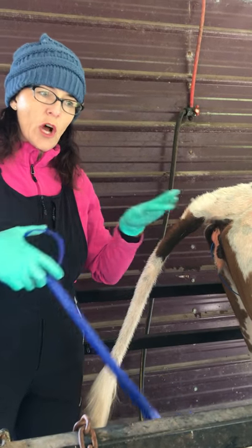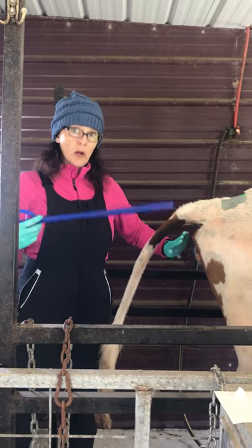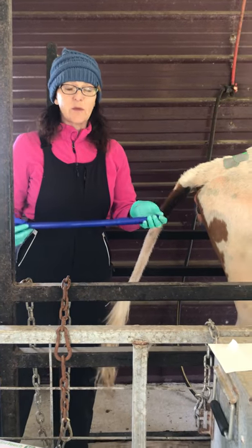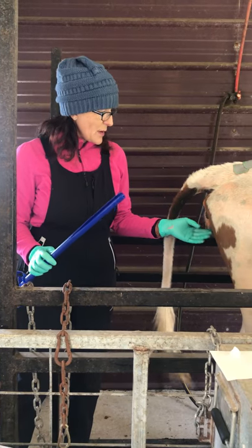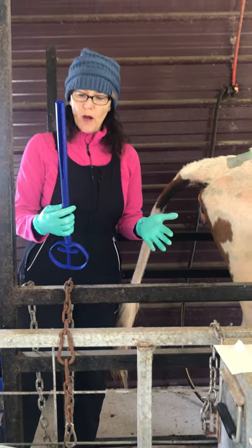That'll make her think she's pregnant — not really, but she'll just stall her whole cycle. Whenever she's ready, we'll make her come back into heat and we'll have a time so we won't be guessing and can get a baby out of her, because dairy cows aren't very good to us if they're not making milk, which requires them having a baby. I hope you learned something.